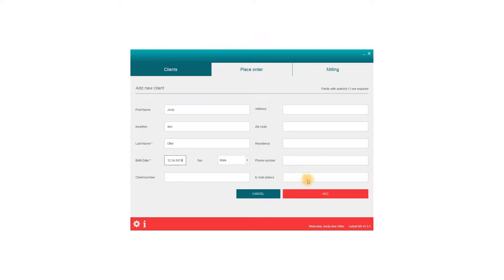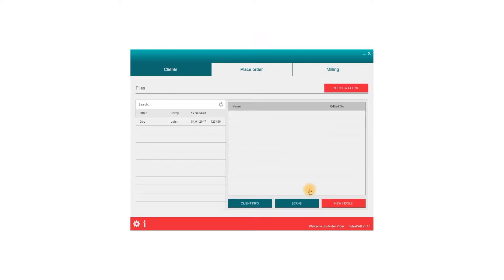To confirm the added client information, click the Add button. The newly added client will appear at the top of your client list and will automatically be selected.